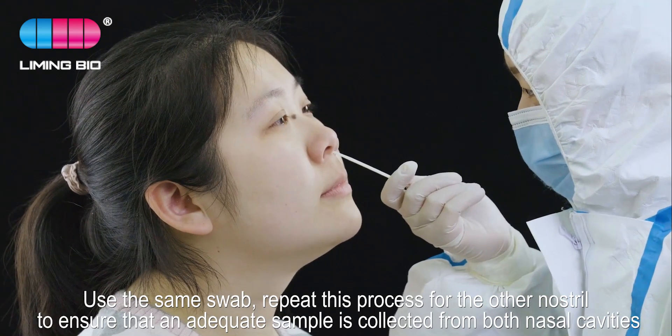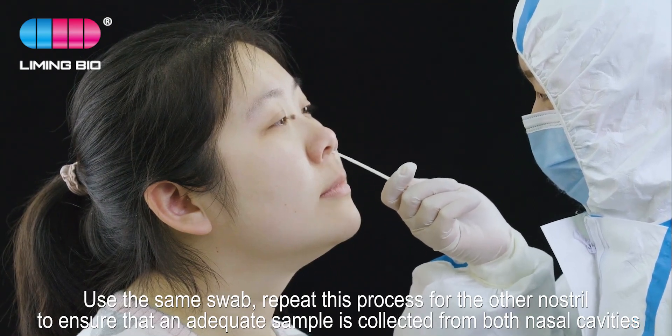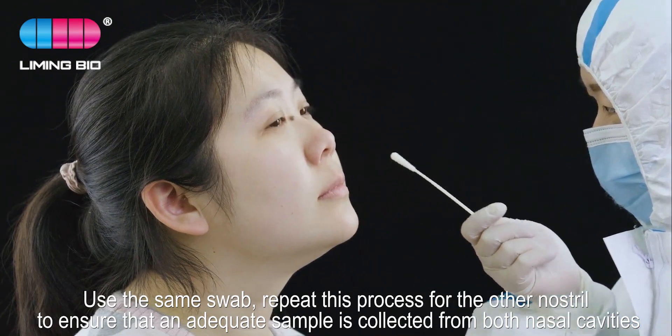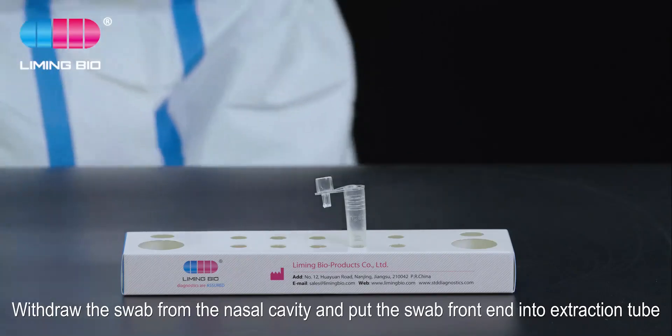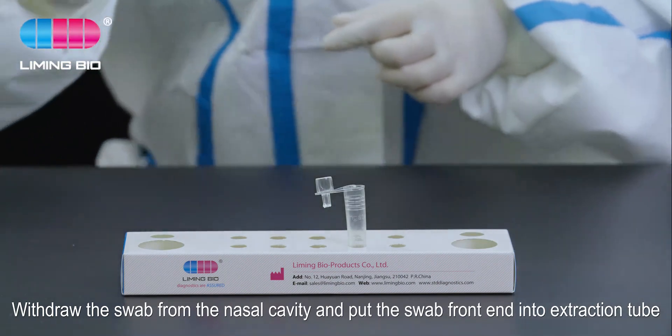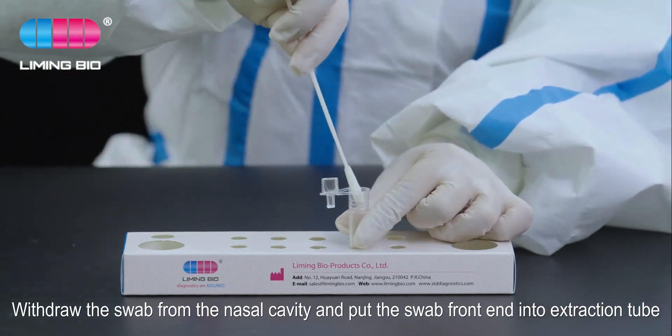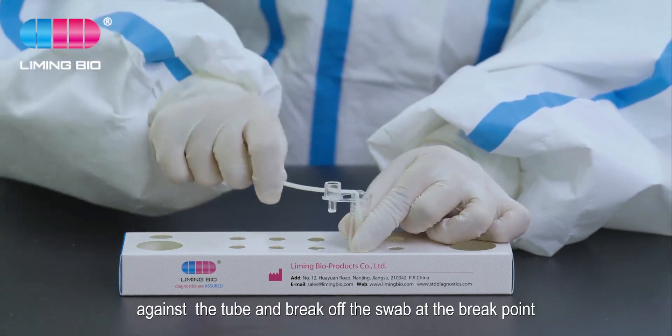Use the same swab and repeat this process for the other nostril, to ensure that an adequate sample is collected from both nasal cavities. Withdraw the swab from the nasal cavity and put the swab front end into the extraction tube against the tube, then break off the swab at the break point.